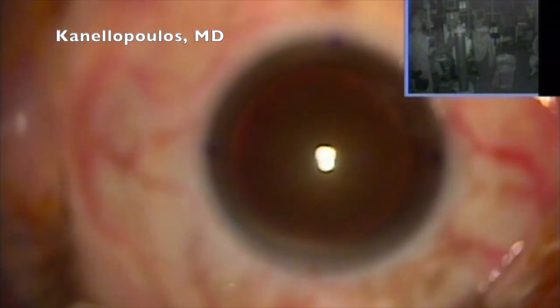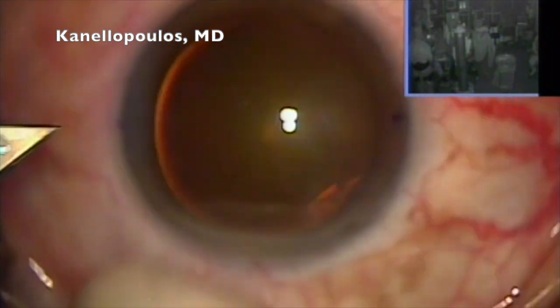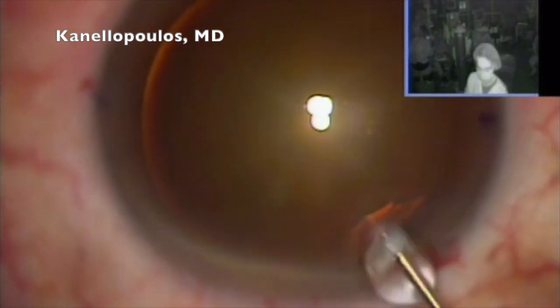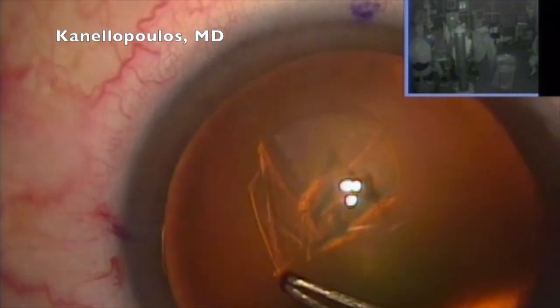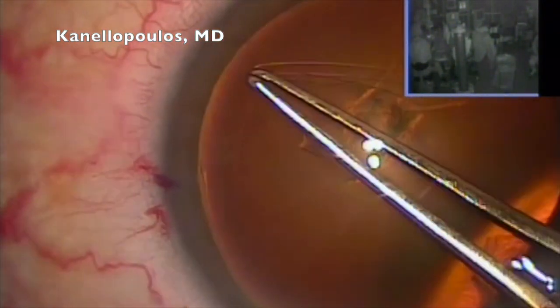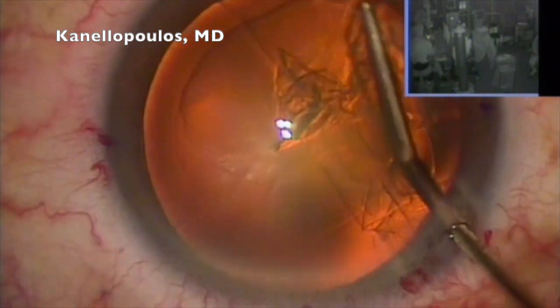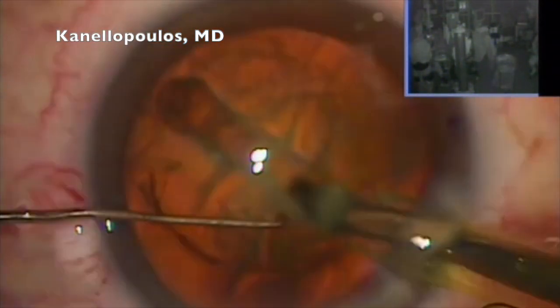We're seeing here a little bit of trigonometry. We're defining the axis of the astigmatism. You can see the 12 o'clock, 6 o'clock mark that we put on the slit lamp. Two incisions. The paracentesis is under 1. Everything is times 8 in speed, so I apologize for this spinning so fast — hydrodissection.